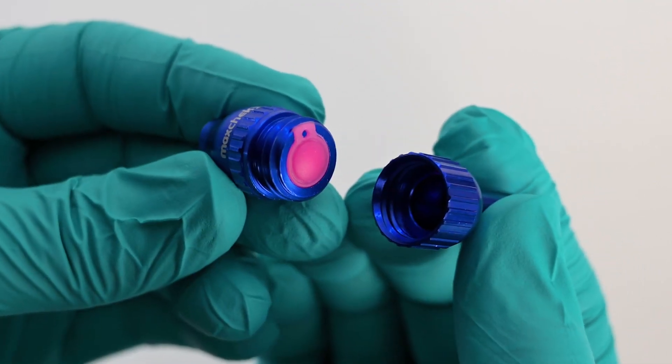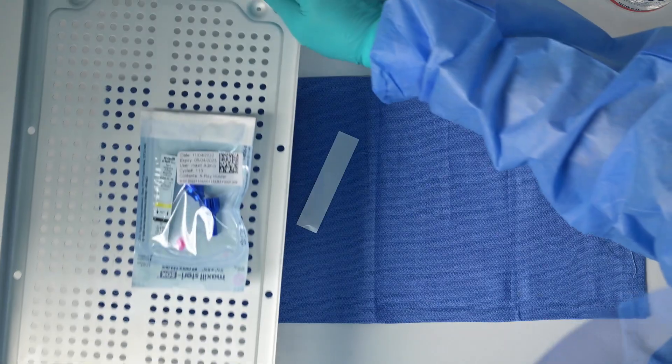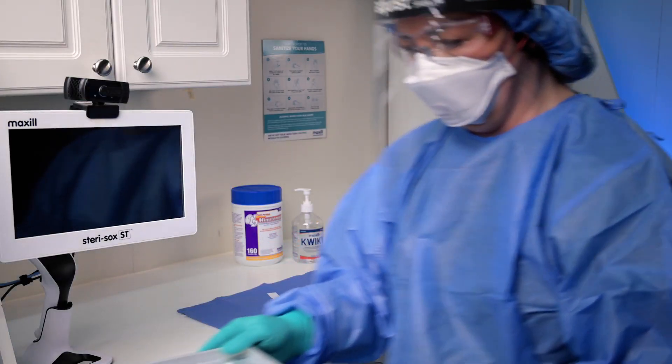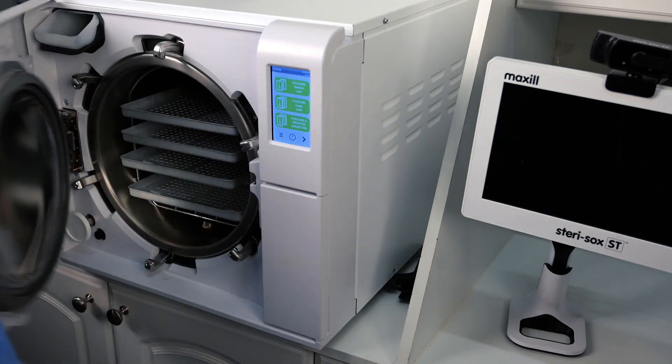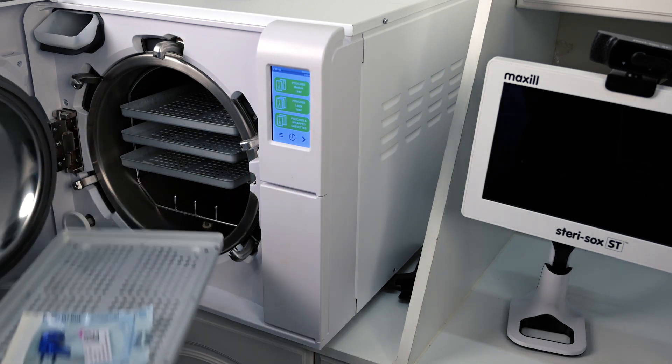It is easily disassembled to reveal the diaphragm inside and remove it for reprocessing using a steam autoclave. The most advantageous feature of the MaxCheck valve is its ability to withstand autoclaving.